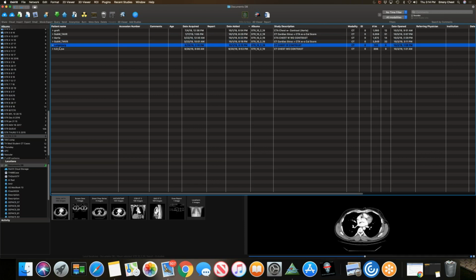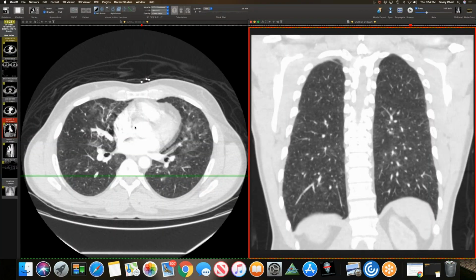Sure. Another thoracic case. So this case was shown to me by my colleague Eugene Berkowitz, and this is a patient with no significant past medical history, 41-year-old, and over the past week he started developing severe shortness of breath, coughing, and was hypoxic on O2 sats.